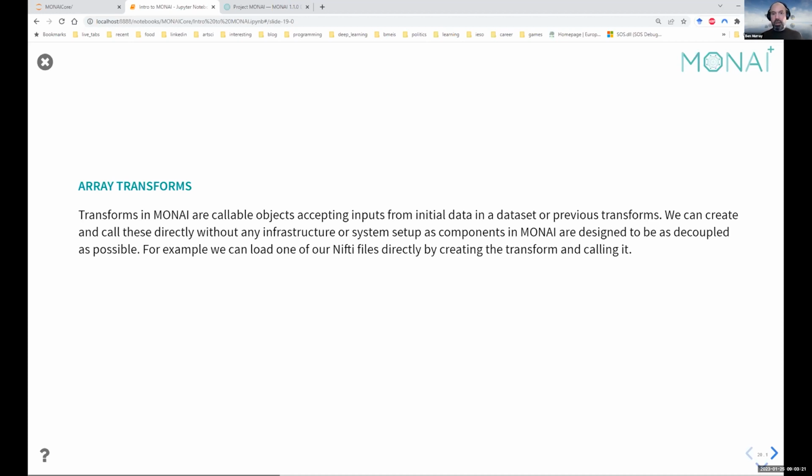Yes, medical images are acquired in different dimensions and slices. How do you handle it? It really depends on your need. If you, for example, are doing some kind of generative network, such as a VAE, where you have a latent space, then you kind of have to remap your data to a common space and every volume must be the same size.